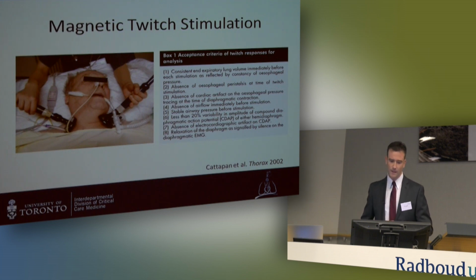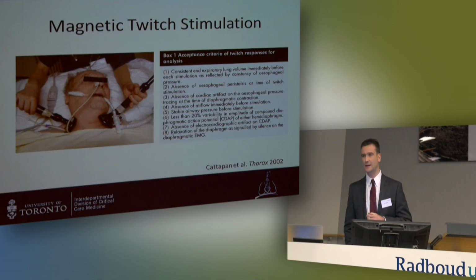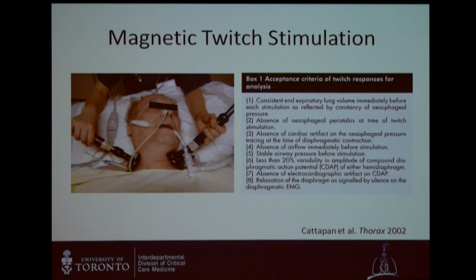the diaphragm. And although I've only used this in the research lab setting in outpatients, it really gives you a very consistent measure of respiratory muscle function. Nevertheless, I think there's a number of challenges associated with this technique. First of all, these instruments are quite expensive. They're not widely available. I think they require a fair amount of technical expertise to employ, certainly initially. And these measurements are probably quite vulnerable to variation in end expiratory lung volume.